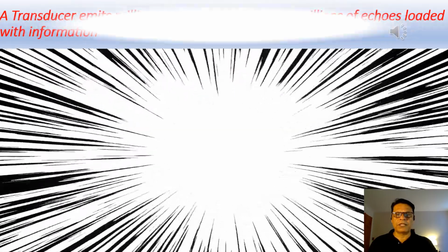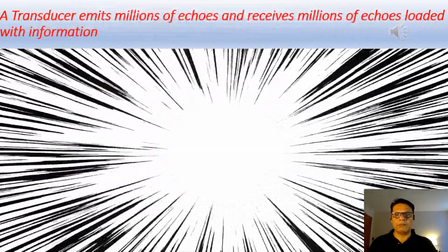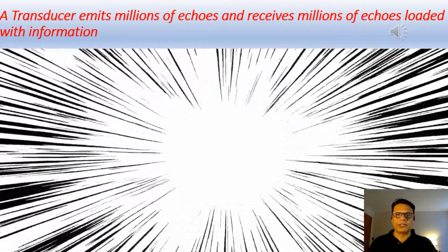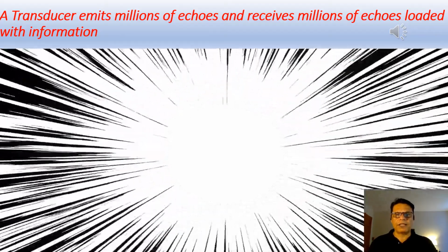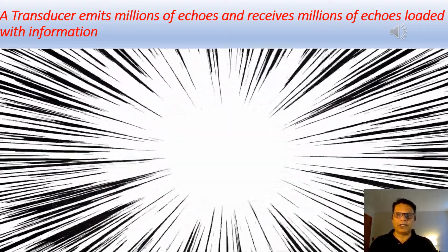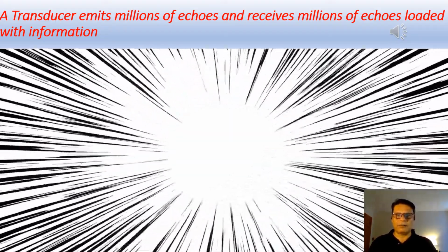And ultrasound sends millions of pulses and receives millions of echoes. So this pulse echo technique is the basis of ultrasound imaging.